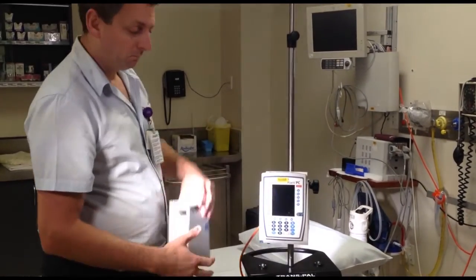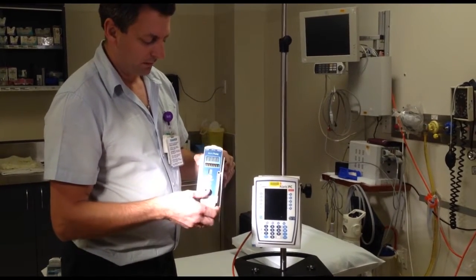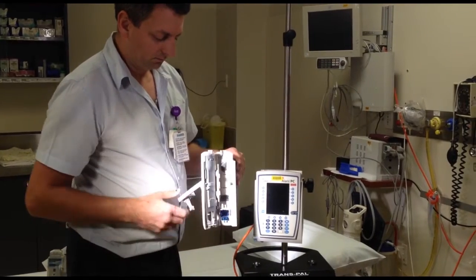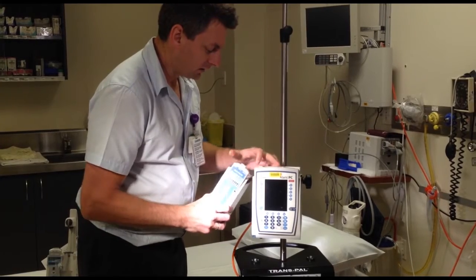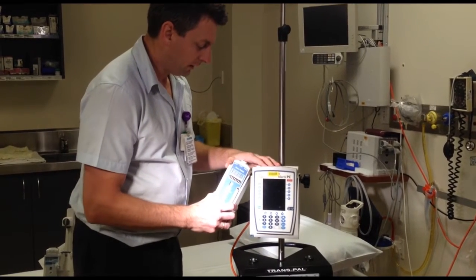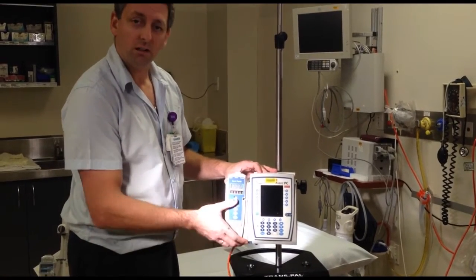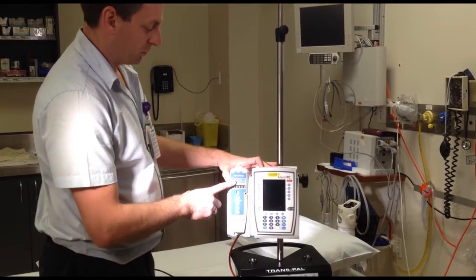I'll go through each module. First we have an LVP — you can tell because it's a blue module and it takes the giving set through the middle. The way we connect them is insert the male end of the module into the CPU at a 45 degree angle and just click down and lock on. When you hear it click, that's locked in and ready to go. So that's the blue module.